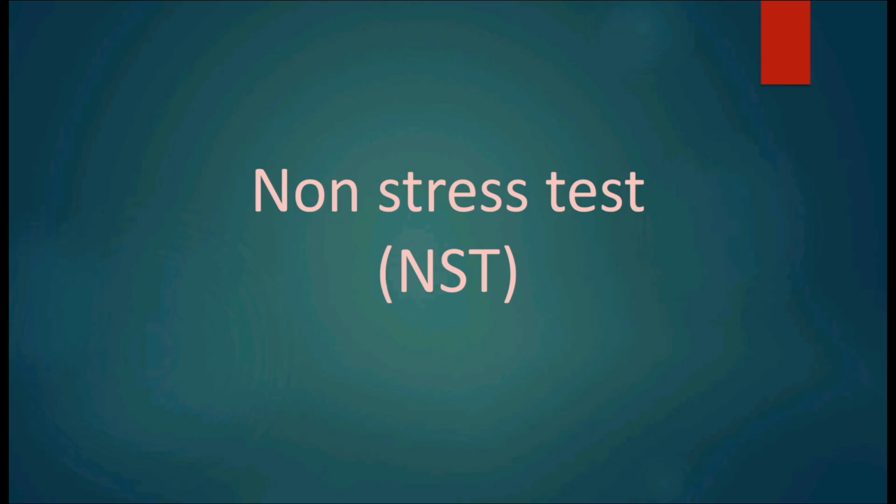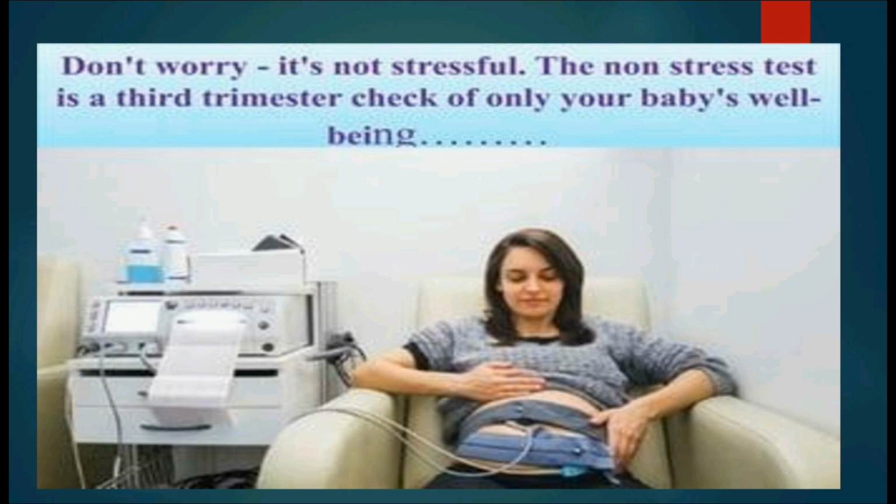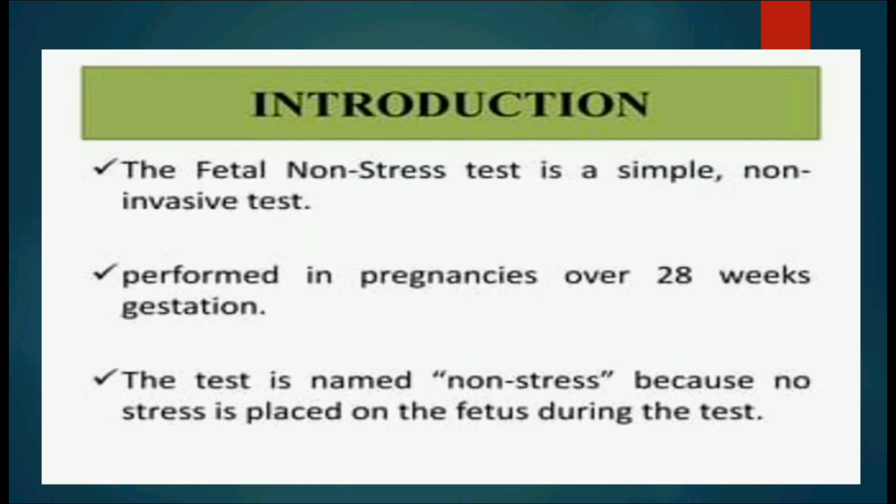Hello everyone. Today we will talk about non-stress test, that is NST. So what do you mean by NST or non-stress test? Don't worry, it is not a stressful test. It is to check the baby's well-being during the third trimester of pregnancy.